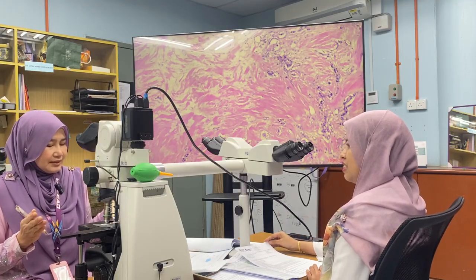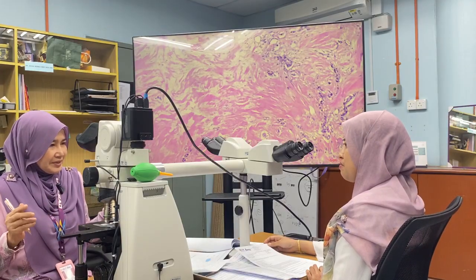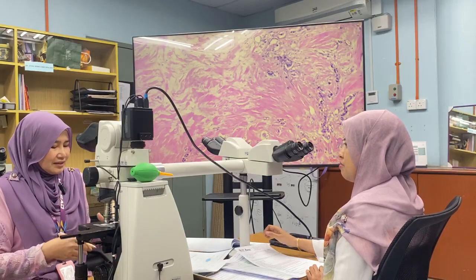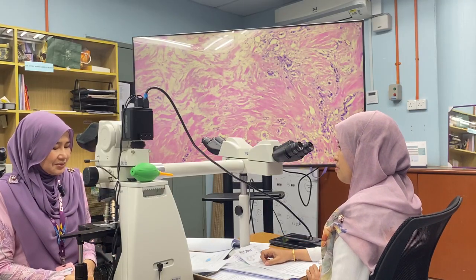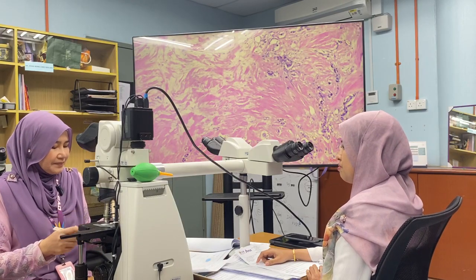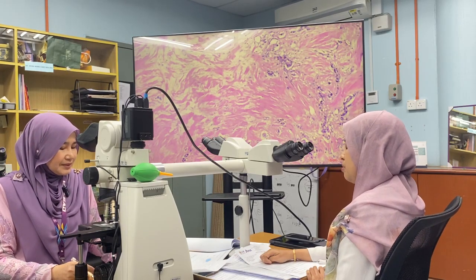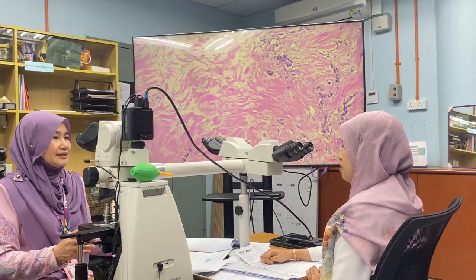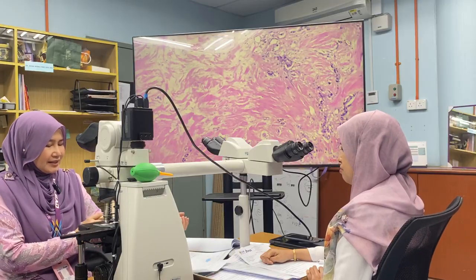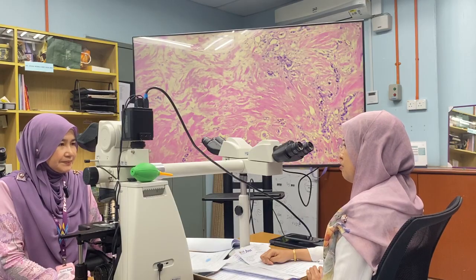Okay, one thing. But before that, of course, you measure the tumor bed, right? Yes. So the tumor bed dimension is part of the residual cancer burden, and then the overall residual tumor cellularity, also in the form of percentage. All right, and then also if you have DCIS, you need to give the percentage for the residual tumor that represents itself as DCIS. All right, and then the number of lymph nodes also indicates the residual cancer burden.